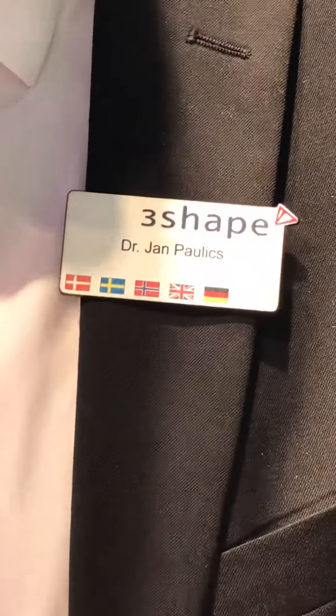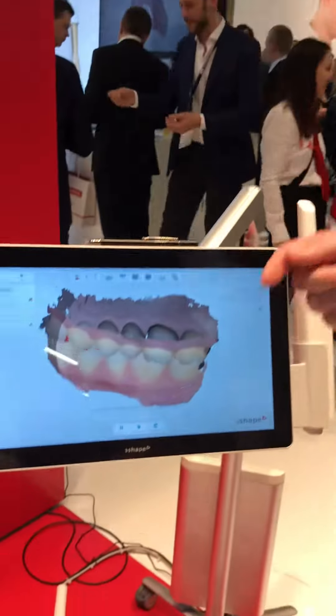Welcome everybody. What we can see here is that after taking the first two scans of the jaws — the lower, the upper, and the normal static bite — normally we would send this to the laboratory. They will mount it in an articulator, and of course now with digital we have a virtual articulator. So the lab technician will try to build up a bridge and try to see all the movements the patient actually does. But now we can actually record the motion of the actual patient.